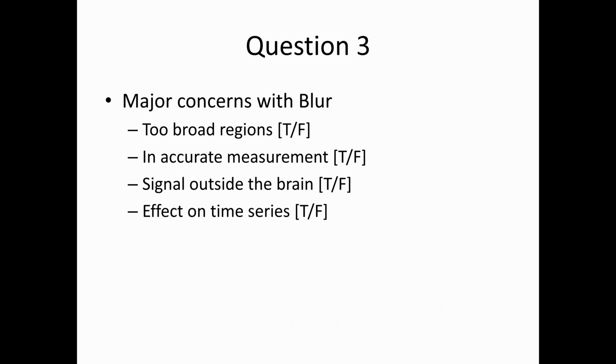Do you mean by blurring adjacent regions that are more susceptible to physiological noise? Yeah, that's why I sort of put it as the major concern. I don't think that's largely those time series things you're going to take care of through AROMA or FIX or time series level data. It can affect things, but I don't think that's the main concern.